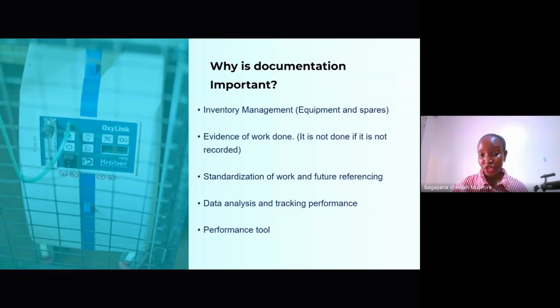Standardization of work and future referencing. This has been explained prior. So our documents enable us to ensure that whichever engineer or technician is out in the field, they're doing the very same thing. So how we are able to regulate or monitor how, say, I would personally do maintenance of a concentrator and how my colleague would do maintenance would be by having documents and following them.